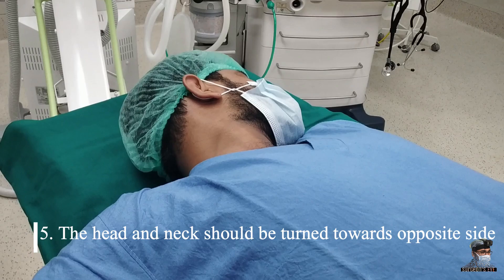That is, if I am doing surgery on the right side, the head and neck should be turned toward the left side, so that the skull will not come in the way while taking the cross-table image of the shoulder.